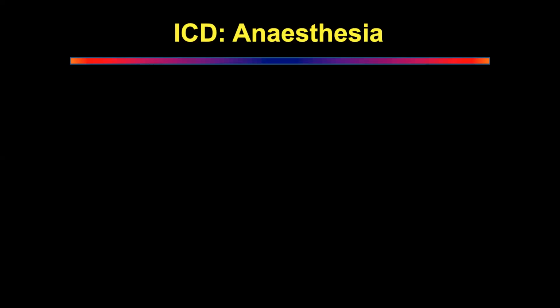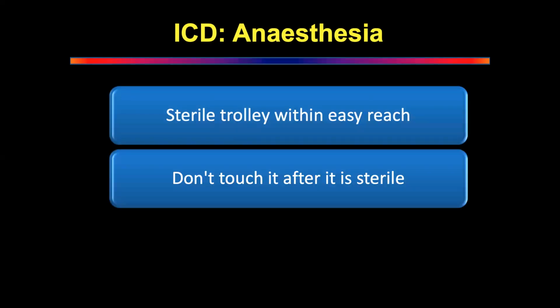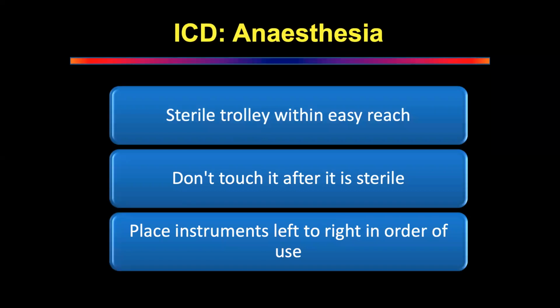Now what are you going to do? You're about to give the anesthesia. I'll tell the patient. Yes, tell the patient. So do not touch it. These are all routine stuff. Make sure that the instruments are all available. And then you always inform the patient before you inject. And you inject.